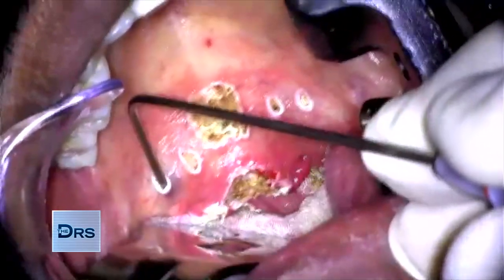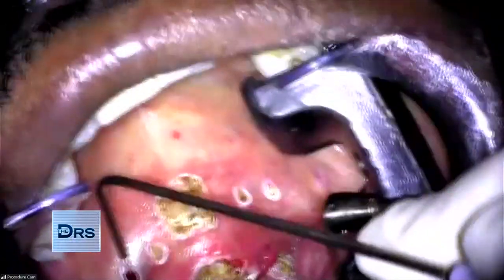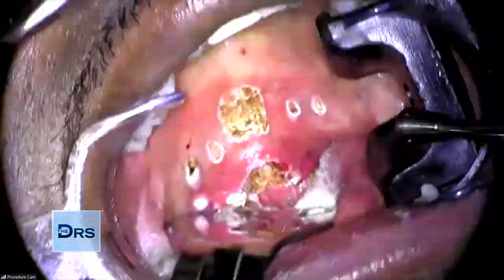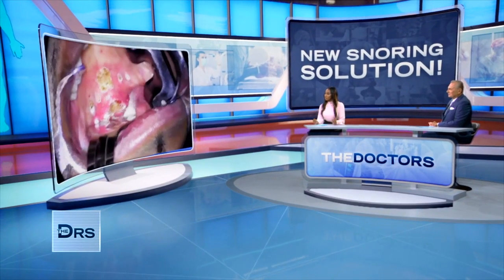So what those are doing is adding support and structure to that floppy, soft palate. It's sort of like you're creating shirt stays in your collar to keep that collar nice and stiff. The scar tissue acts as sort of a shirt stay and keeps that palate firm, correct? This only takes about 3 minutes. We're done. That's the end of the procedure. In 3 minutes, the freight train is just gone.